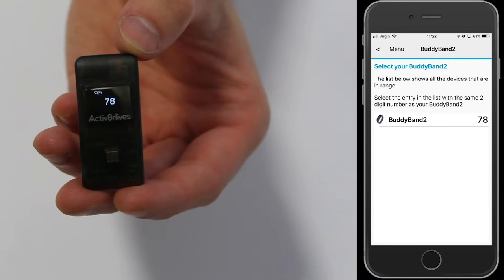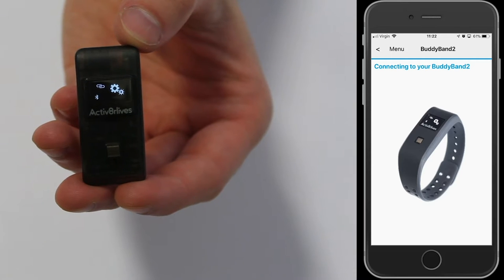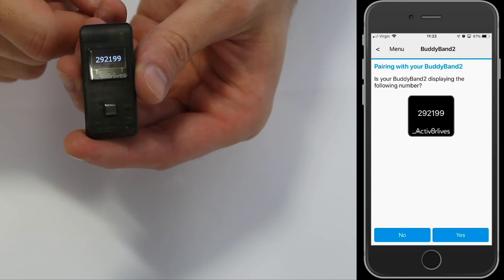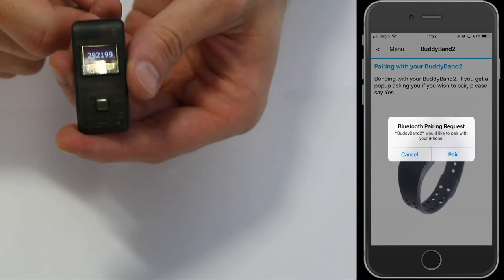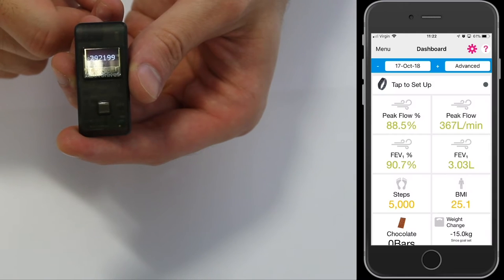If the number is the same, touch the number on the app screen. Then you will get a 6-digit code, and this adds a second layer of security to your data as it is transmitted to the app. Confirm if they are the same by pressing pair.